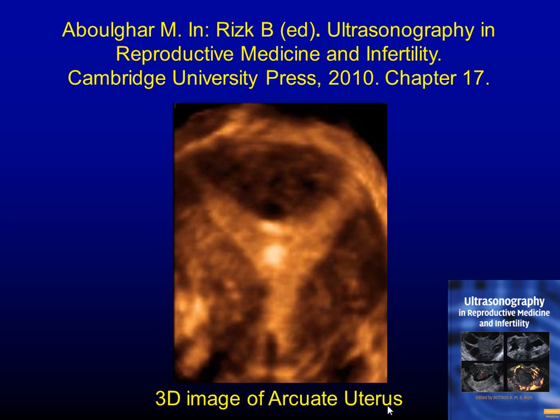Similarly with hysteroscopy, if you use, for example, an office hysteroscope, the amount of fluid that you inject is moderate or low, so it will appear more denting down. When you take the patient to the OR, it goes up. Also, when you cut, you want to cut a little bit above that. In one of our series where I did a second look on many of those patients whose septum I had resected, in about 15% of them, I had undercut this section. In other words, when I looked back, it wasn't good enough. I should have done more.